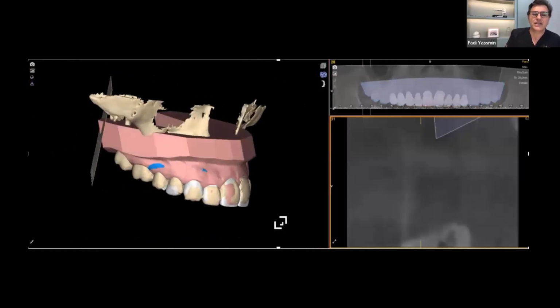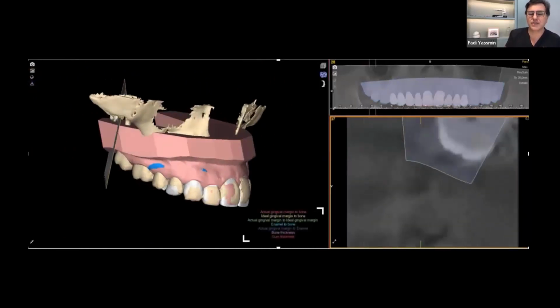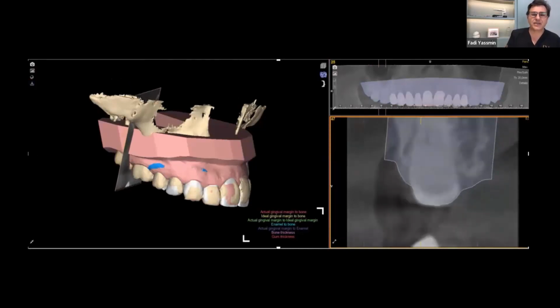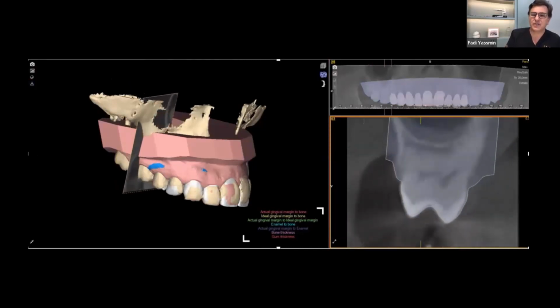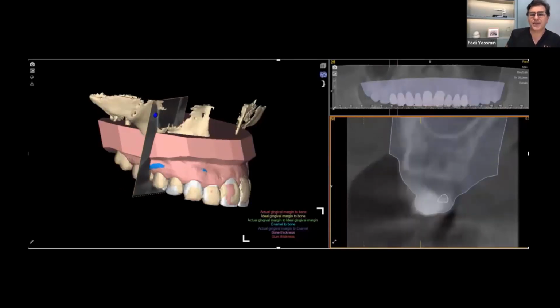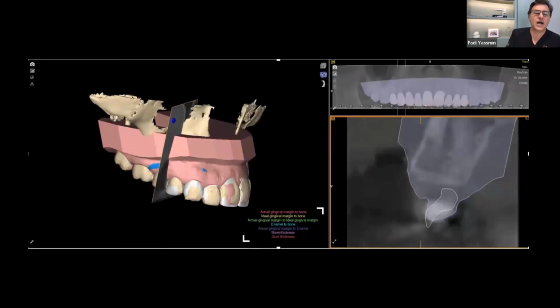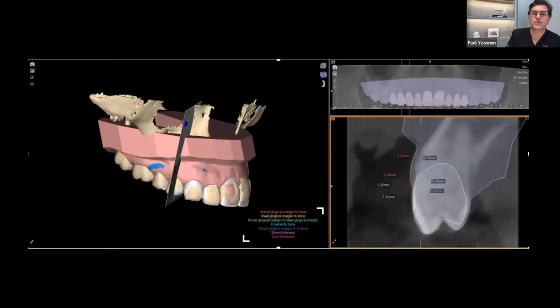So the ideal tooth position couldn't be achieved just by prepping the teeth. There also had to be an analysis of the bony margins, the gingival position, and then use that as the guide to be able to design the ideal and final bone levels.